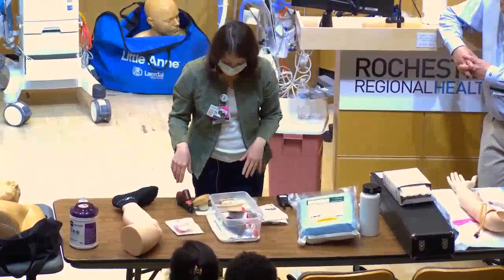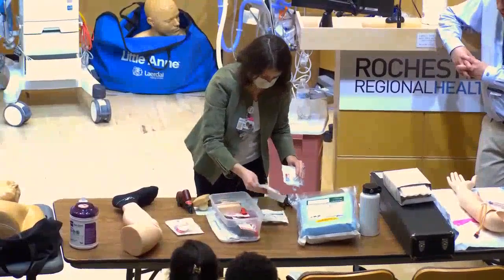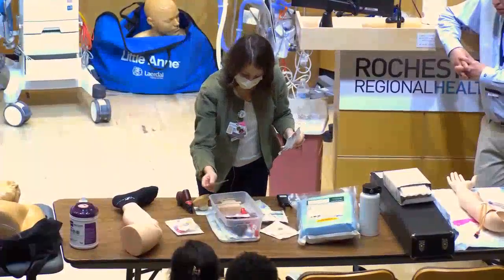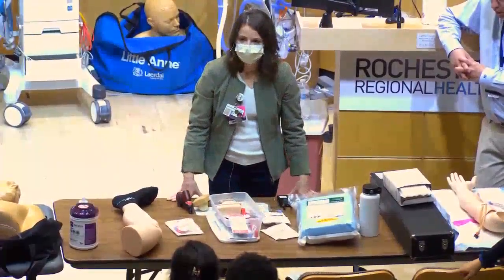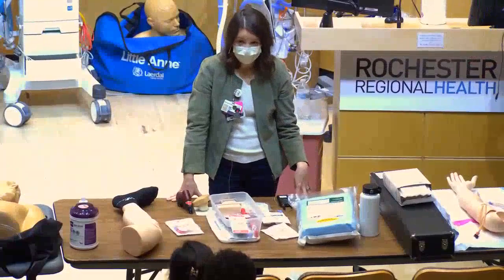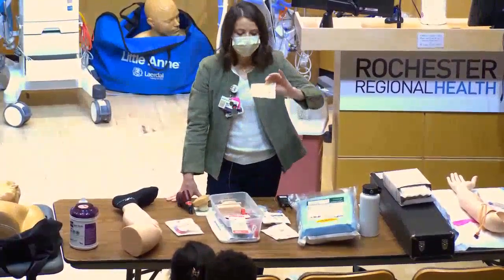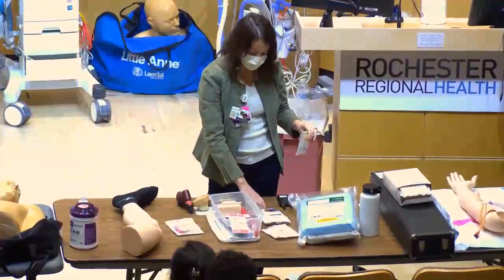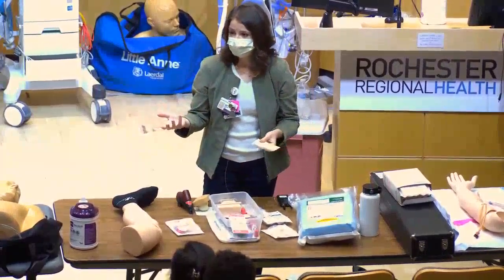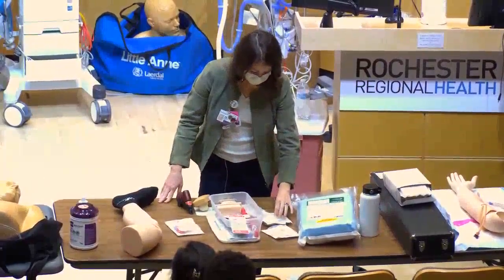There are three color-coded needle sizes. Pink is generally reserved for pediatrics — patients under 40 kg. Patients above 40 kg get either the yellow (45 mm) or the blue (25 mm). You assess how much subcutaneous tissue the patient has and choose accordingly.